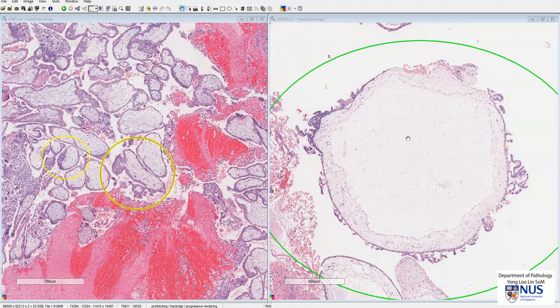In summary, this case of hydatidiform mole is part of the spectrum of gestational trophoblastic disease, characterized by hydropic or swollen chorionic villi with central empty-appearing cisterns and with circumferential trophoblastic proliferation. Thank you.